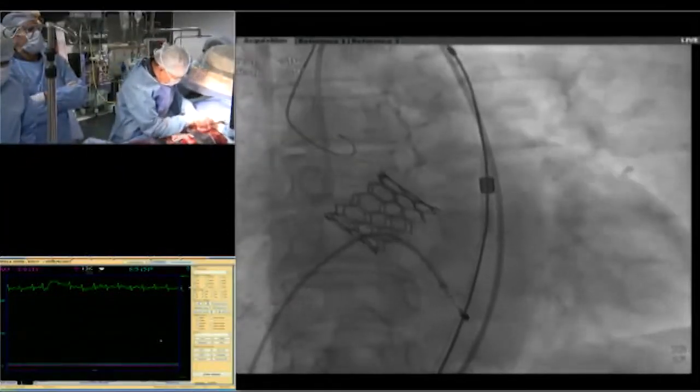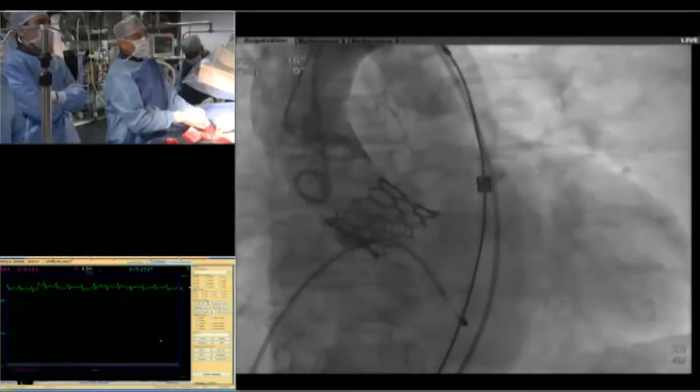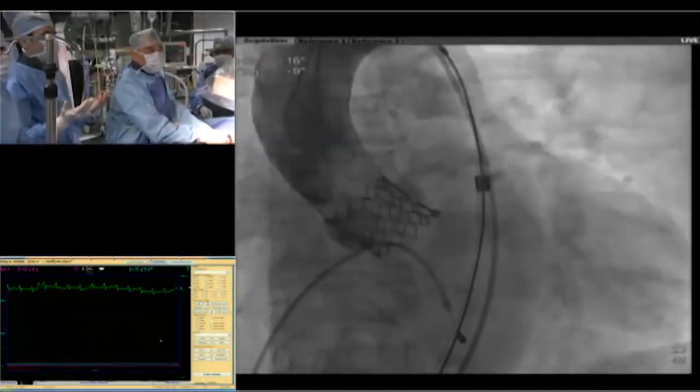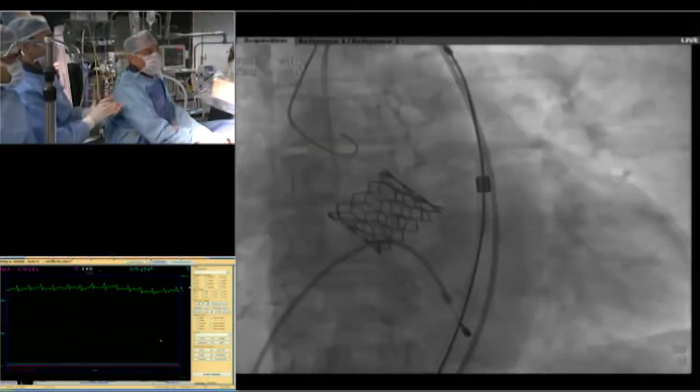Okay. Table down, please. Just show the last picture. Table down. I think that's a good aortogram. We just see a whiff of contrast. Give a call to Raghu. I think we're done. We're okay. Very nicely done.